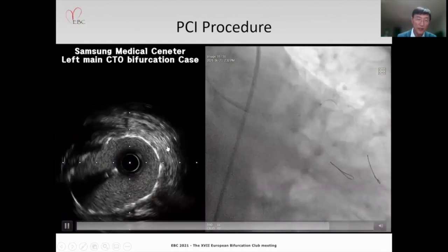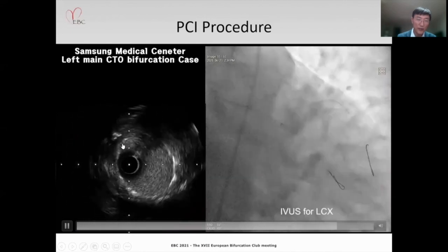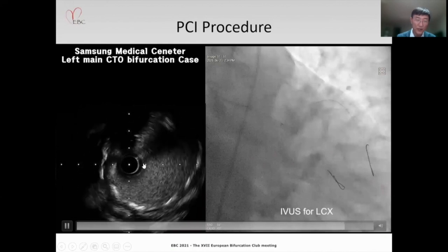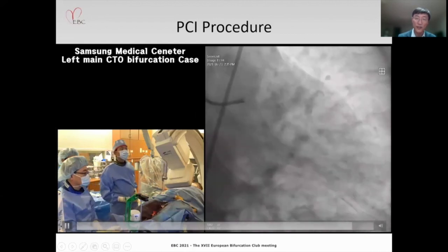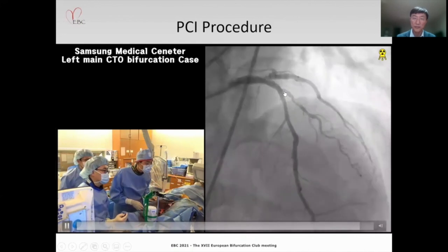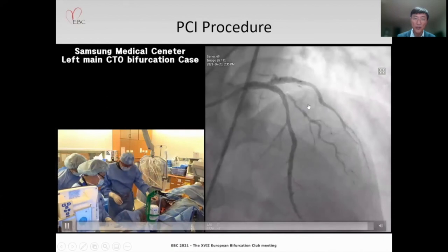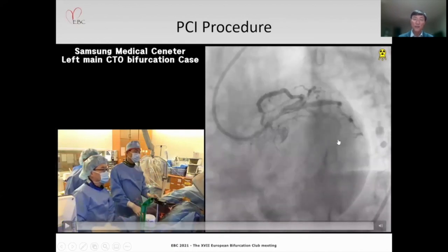This is IVUS from LAD, so wide open and very short. This is IVUS from circumflex. Circumflex ostium is wide open, and you could see the very short stent carina. This is the final angiography. The diagonal ostium is pinched, but we have no problem with that, of course. Okay, this is the end of my presentation. Thank you very much.